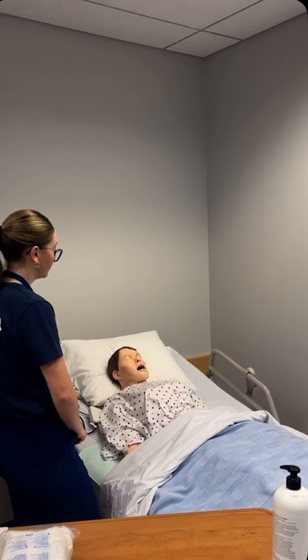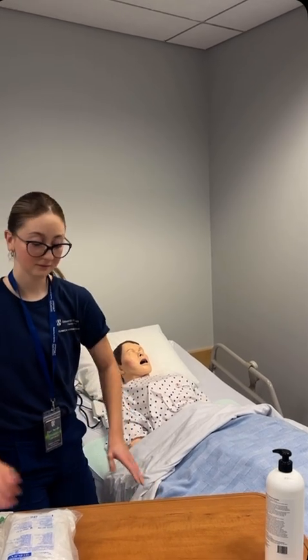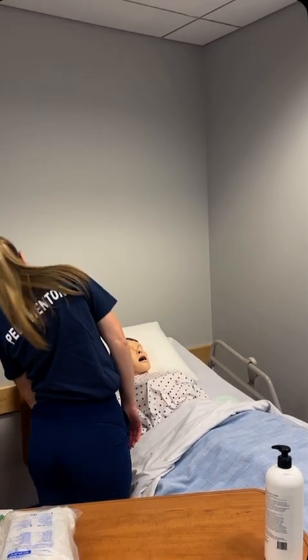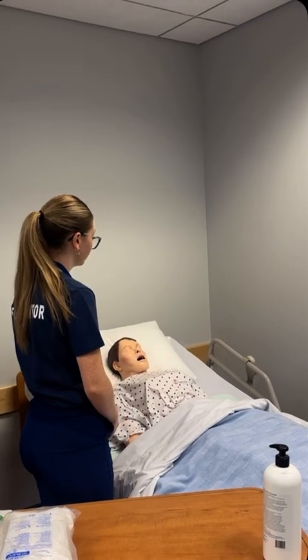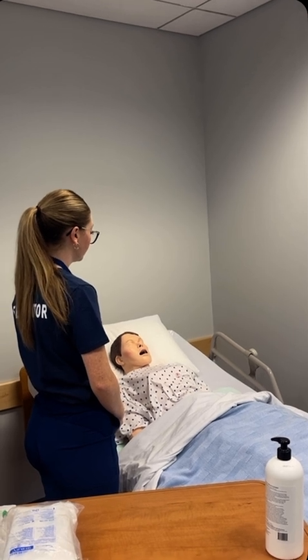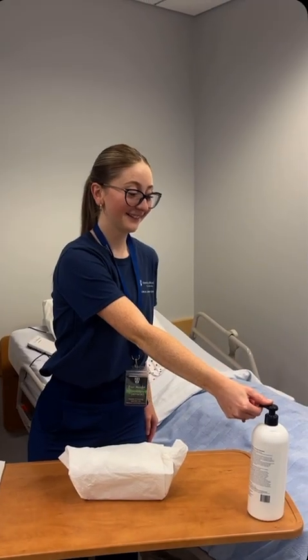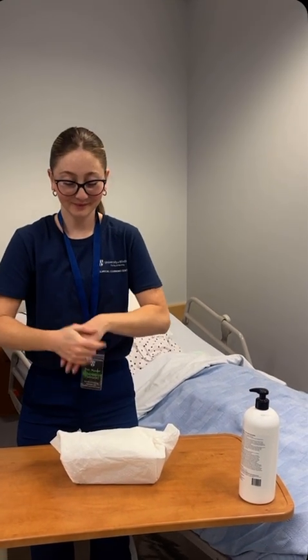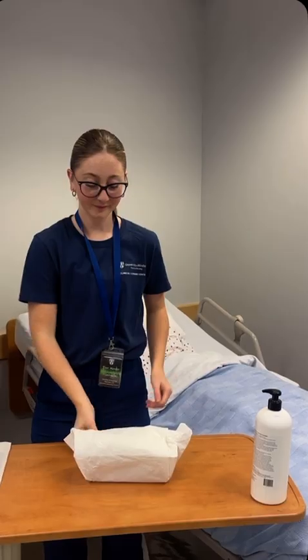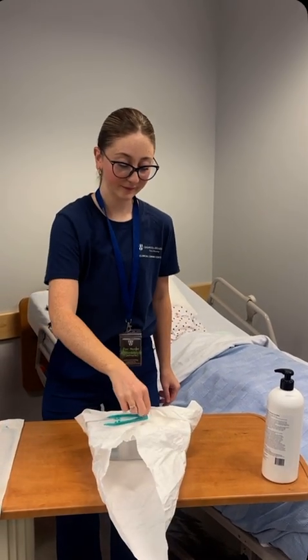Positions self on the dominant hand side of the bed and positions the tray and bed at a comfortable working height. Raises bed rail on opposite side of the bed, positions patient appropriately, ensuring adequate lighting. Performs hand hygiene and opens sterile tray using sterile technique. Does not open with arm over the top of the sterile field.